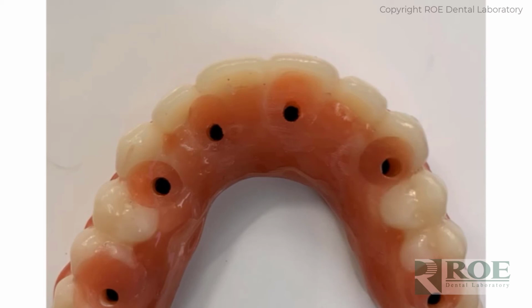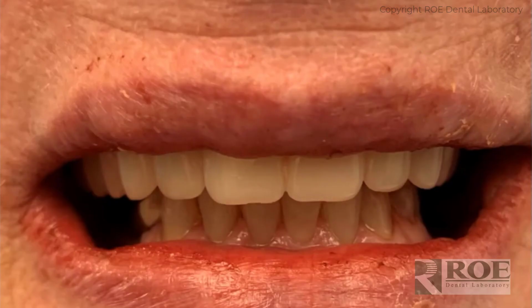And then the prosthetic goes back in the laboratory, and it is cleaned up, intaglio and occlusal, just to make sure there's no holes or voids, and smooth everything out, and then take it to the mouth and equilibrate. You'll see in other videos there's a lot more detail on the conversion part of a case, but we'll just kind of go through this one pretty quickly. And then the prosthetic is seated.